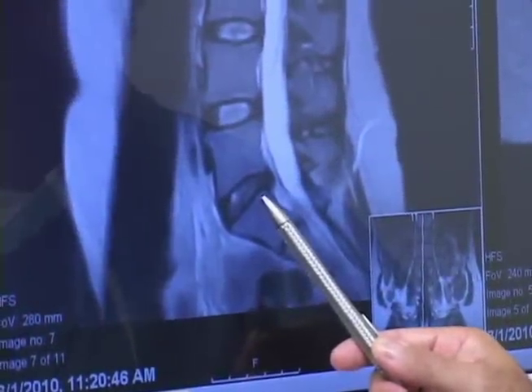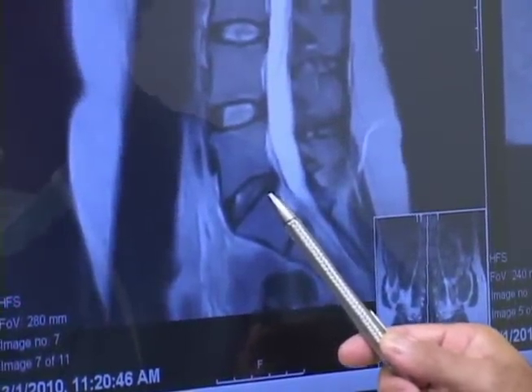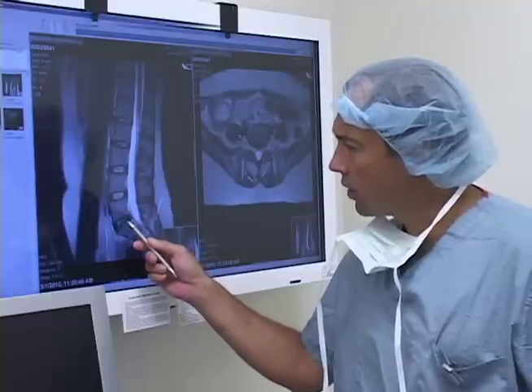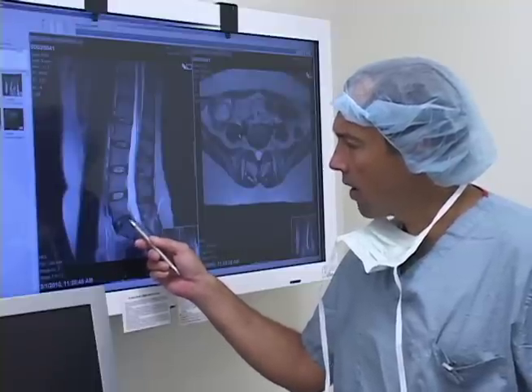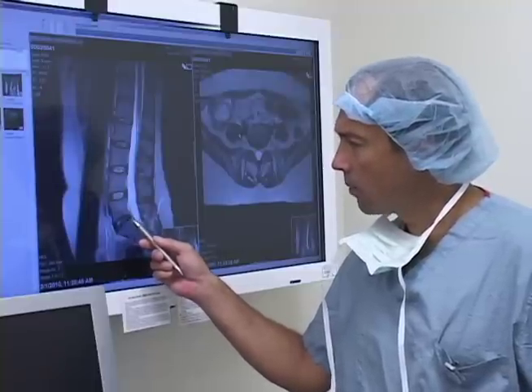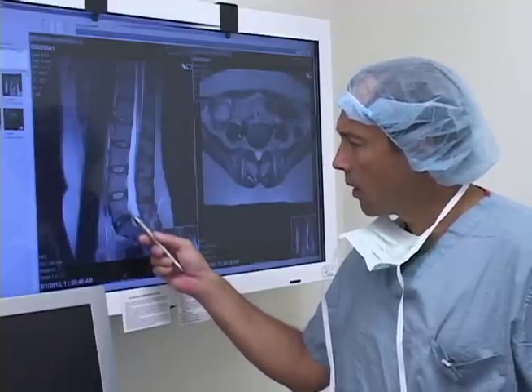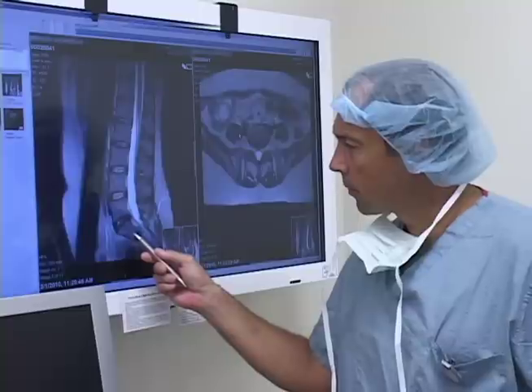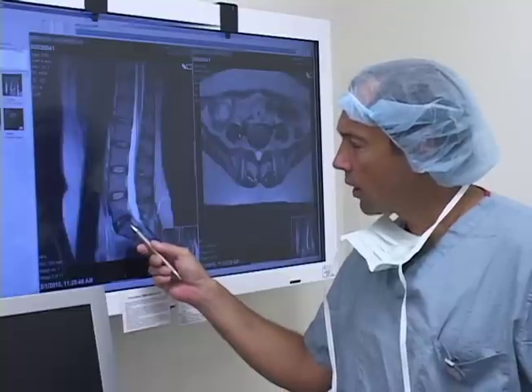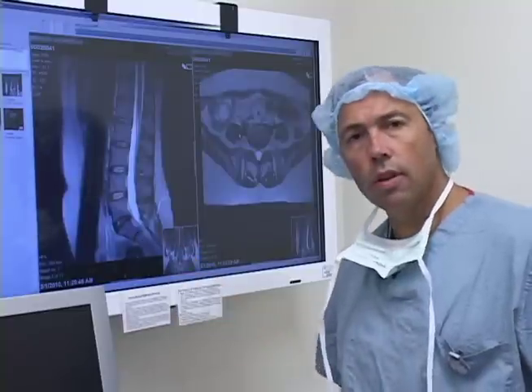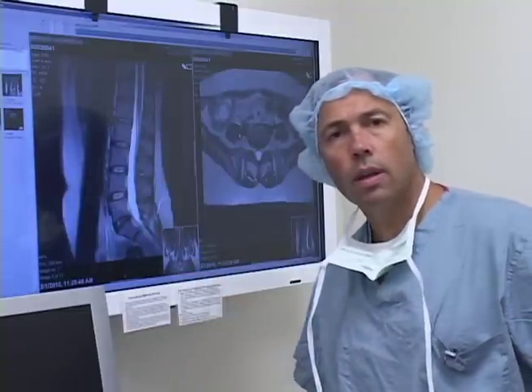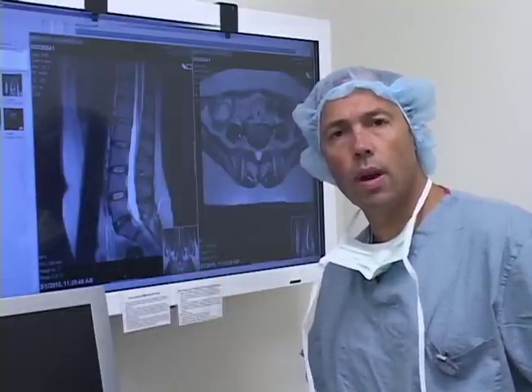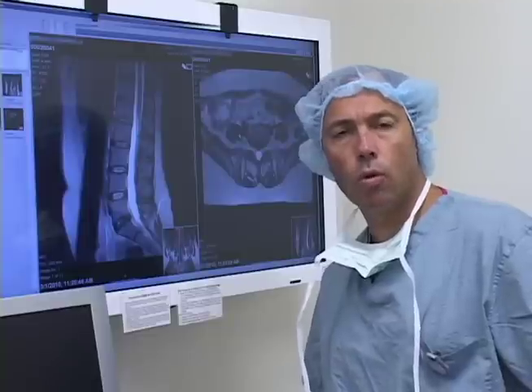On these x-rays, this is an individual who has degenerative disc disease at the L5-S1 level. The disc is protuberant, it's dark, and essentially this is what we determined to be the source of her chronic low back pain.